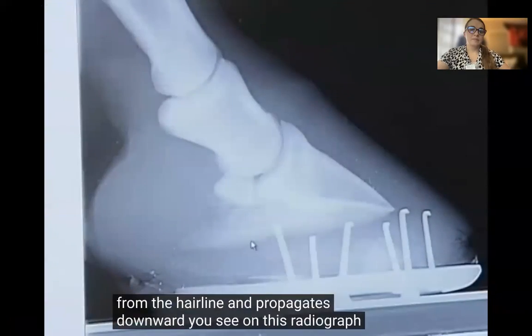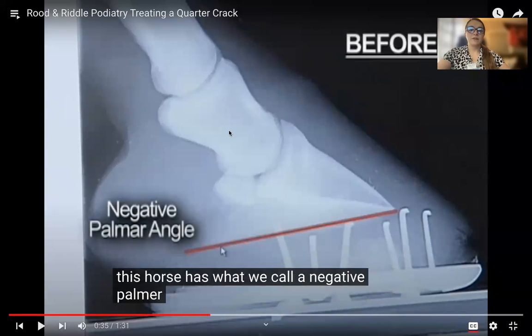You can see on this radiograph here, this horse has what we call a negative palmar angle. So they're going to be taking radiographs of these horses before and after shoeing. With podiatry, again, they're paying quite a bit of money for these doctors to look at these horses and do custom corrective shoeing. So they're going to take radiographs.